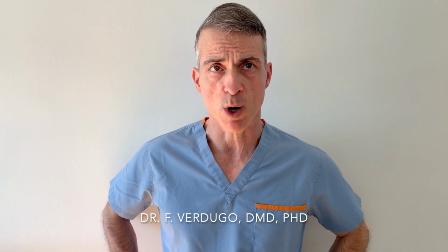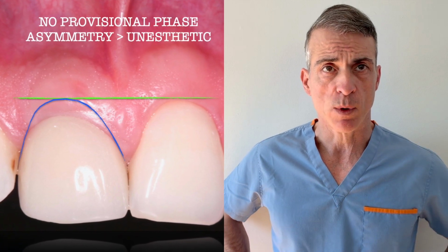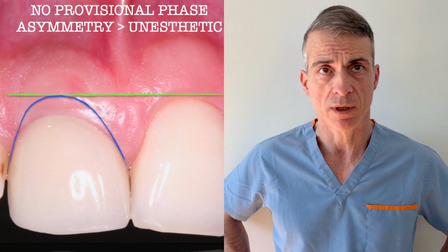It is highly unlikely that you will achieve a good aesthetic outcome, optimal outcome, if you skip the implant provisional restorative phase. This is an example of a suboptimal clinical outcome of a front anterior implant that was placed and did not receive the proper provisional phase. The restorative dentist skipped the provisional phase, and as a result, the clinical outcome was not aesthetic because of lack of symmetry and a mismatch in the soft tissue margin between the implant and the adjacent tooth.